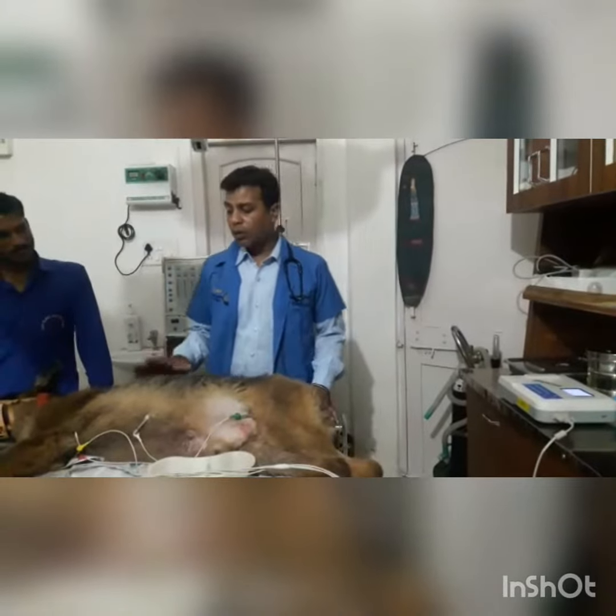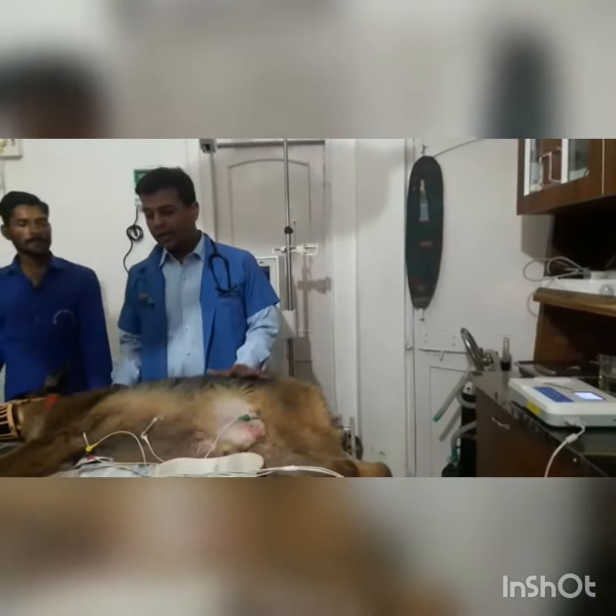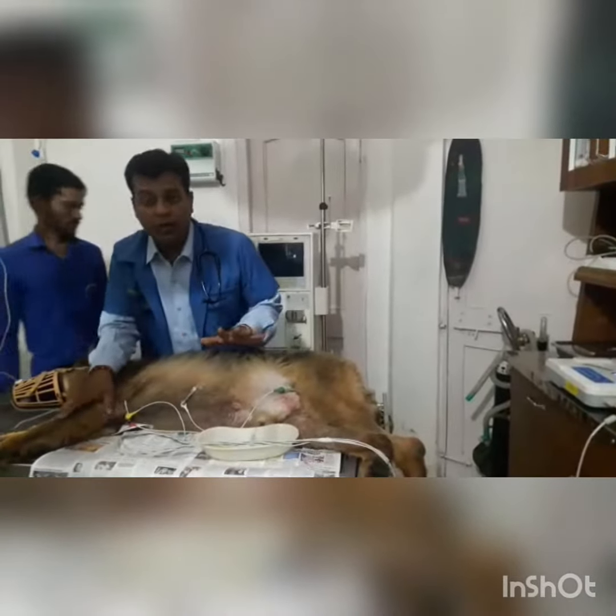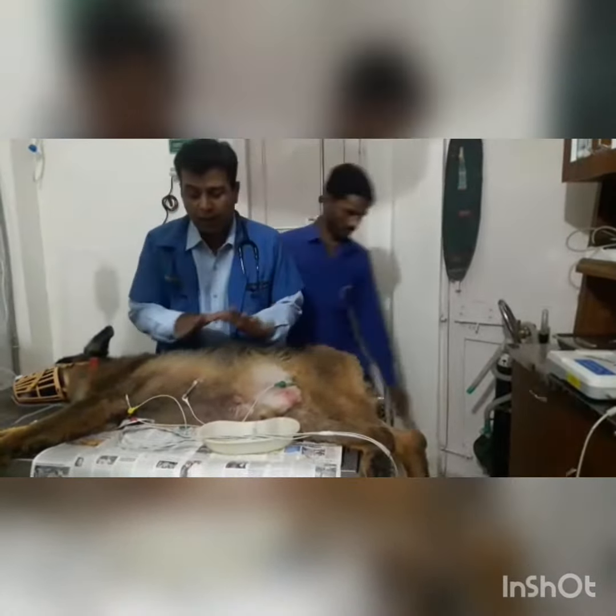I will show you how to put the clips on a dog. The dog is lying in the lateral position. There are 5 clips: two in the forelegs, two in the hindlegs, and one is for the chest/cardiac area.